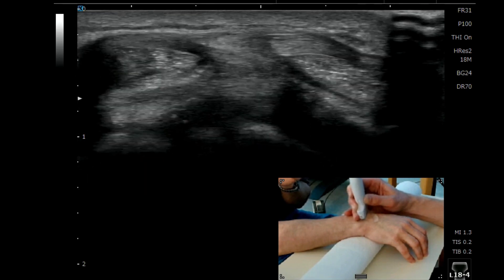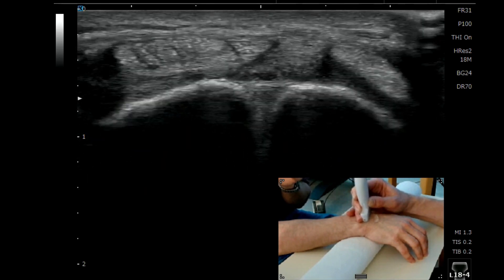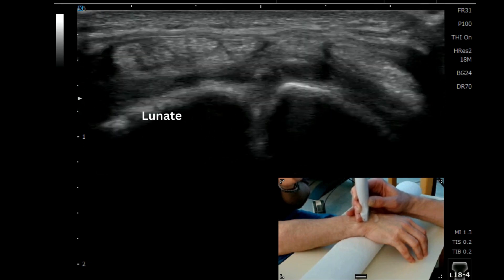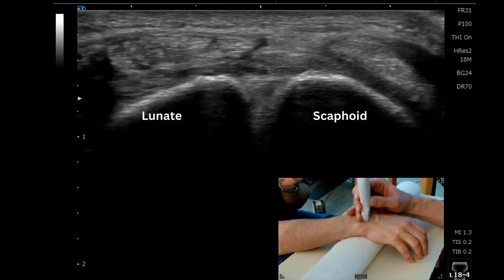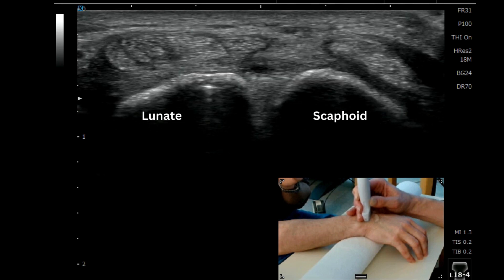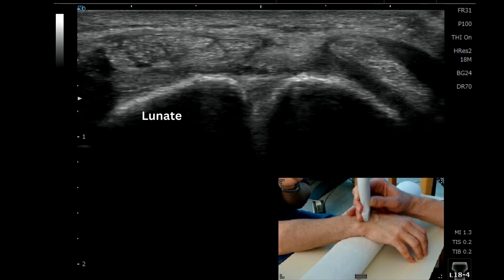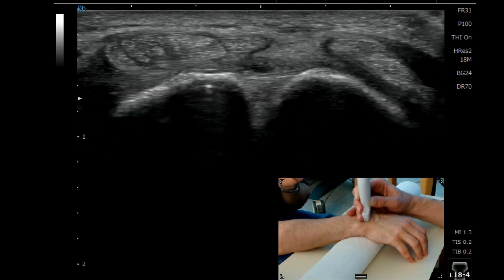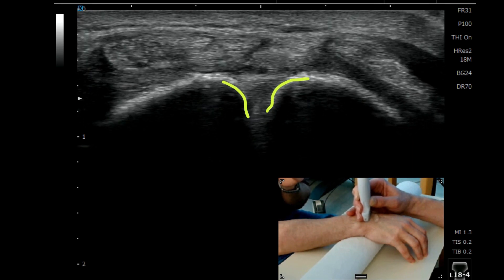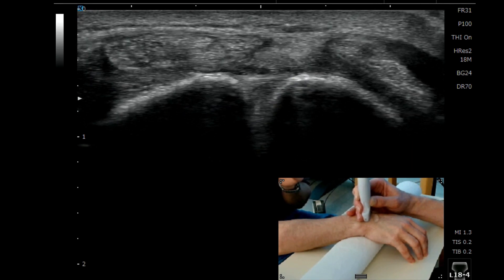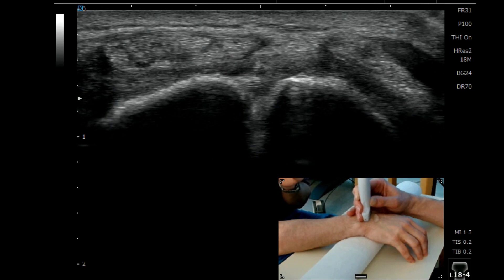You're going to roll down, and then you're looking for the lunate on the left and the scaphoid on the radial aspect on the right, and it's that small little V-shape in the middle there. You can see those echogenic aligned fibres bridging between the two bones there, and that's the dorsal fibres of the scapholunate ligament.